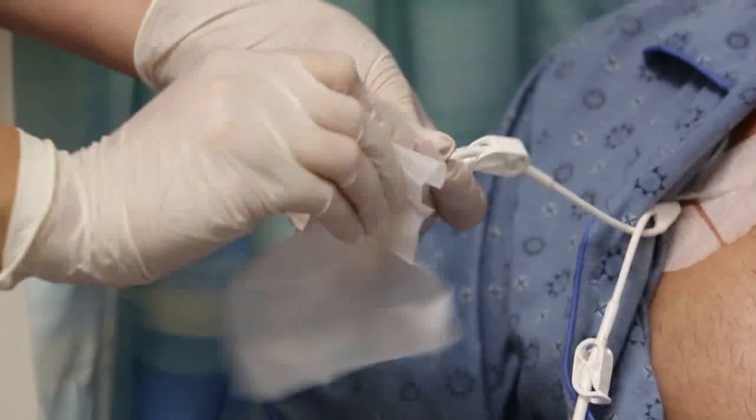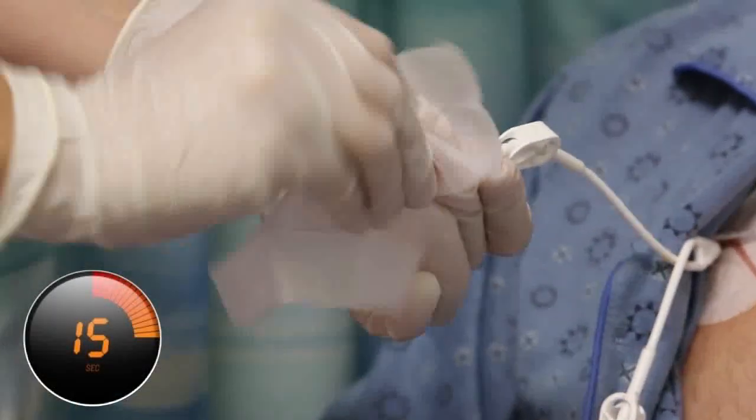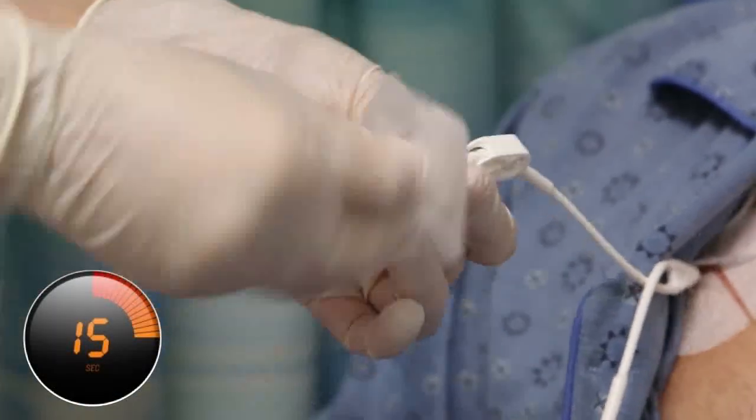Open the chlorhexidine wipe carefully and perform a hub scrub by thoroughly cleaning the port for 15 seconds, creating friction while doing so. Allow to dry.